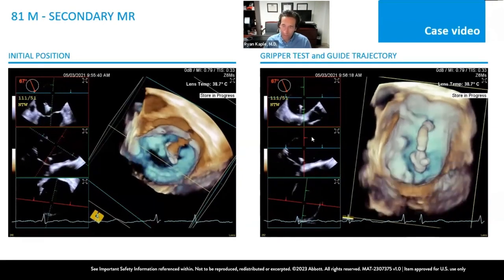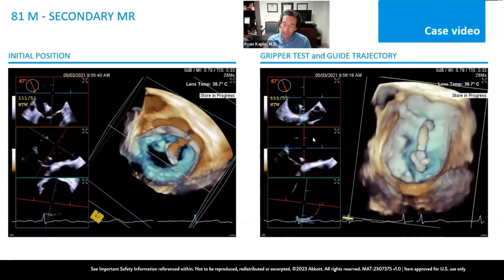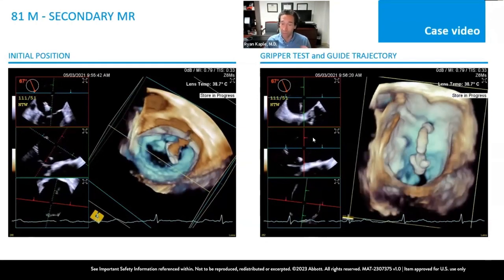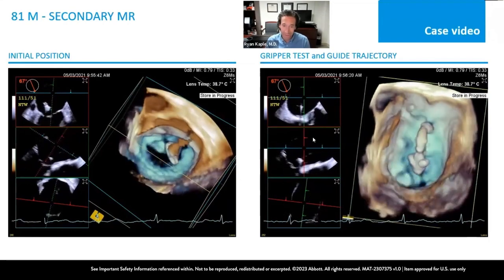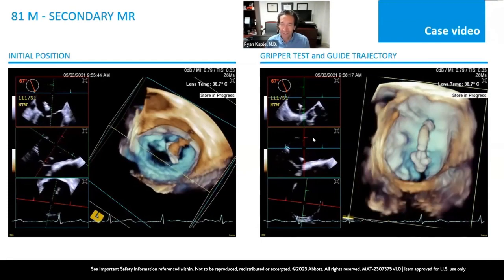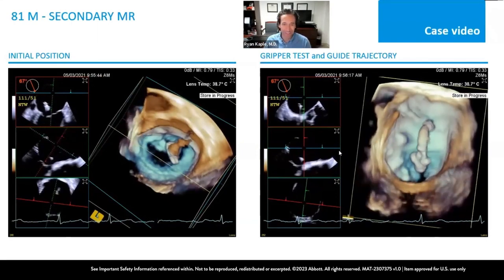We usually test the grippers, so testing the tactile marker on the back. And this is a really important part to be clear with each other in terms of make sure you're both double checking that you have checked the grippers before you go down into the ventricle, but also saying, I'm testing the tactile gripper now, are you ready? And making sure that you capture it. Because if someone forgets, you can always go back and say, right, we tested that one first.